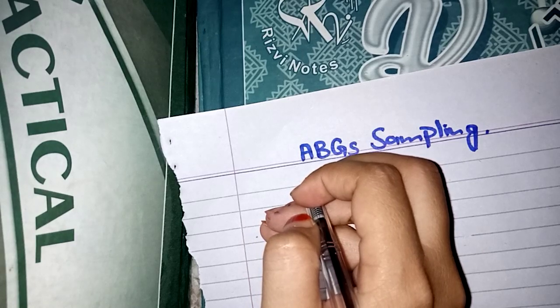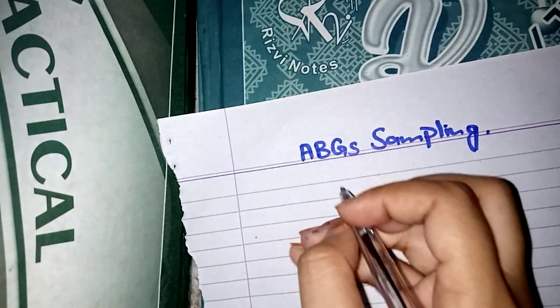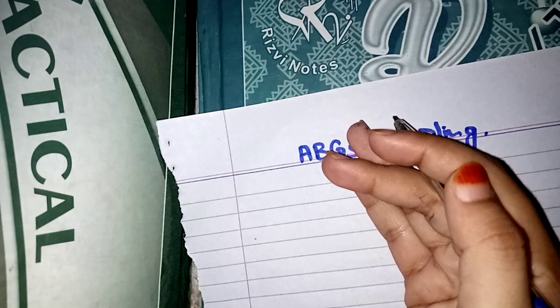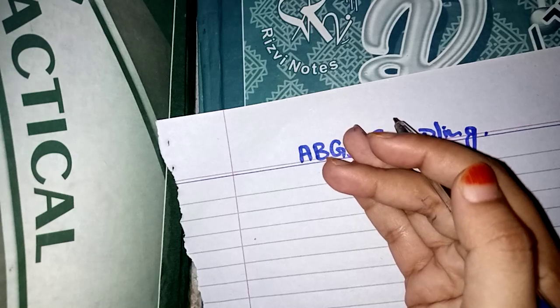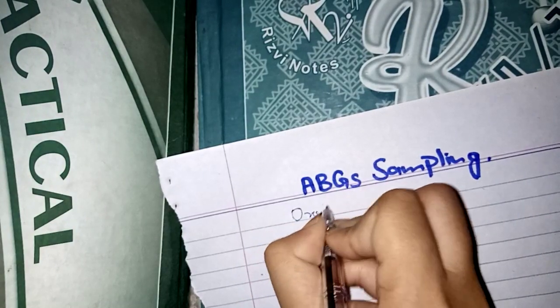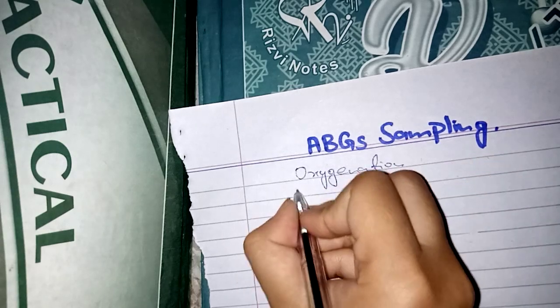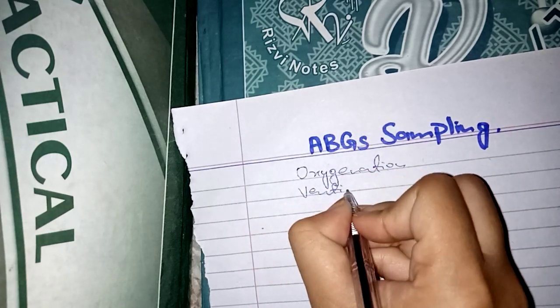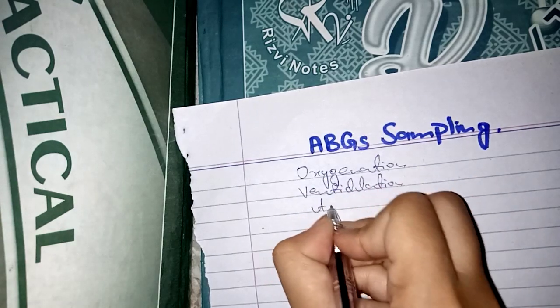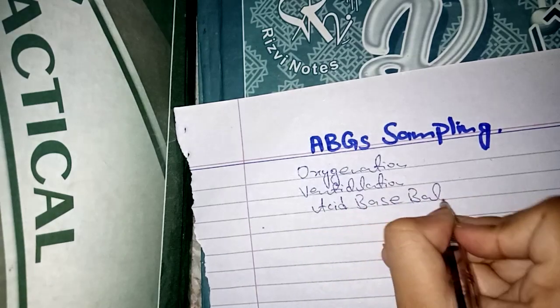ABG sampling: how and when to do it. With the help of ABG sampling, we get to know about the oxygenation status of the patient, ventilation status, and acid base balance.